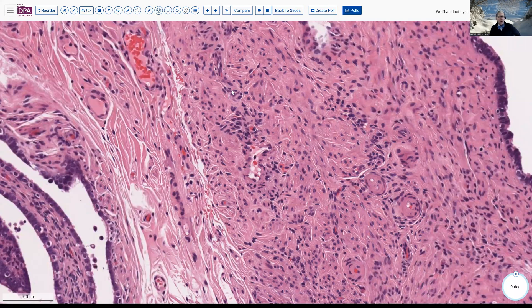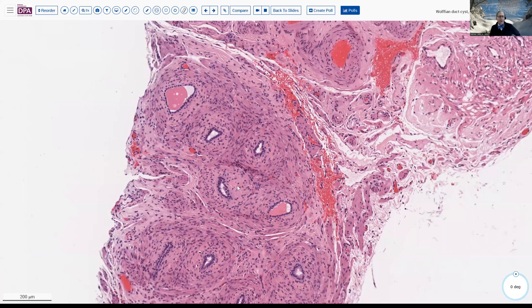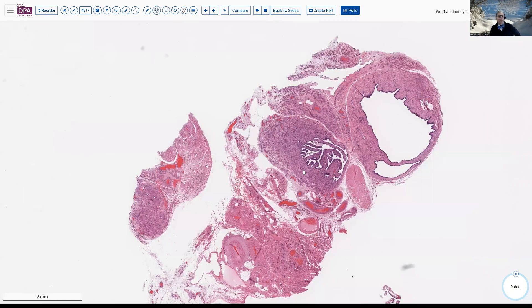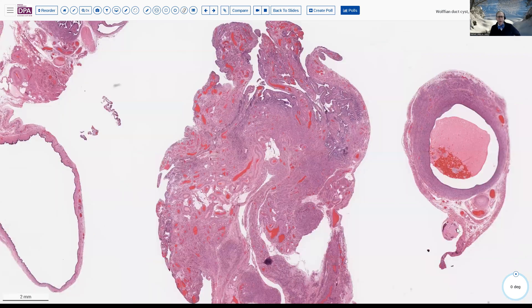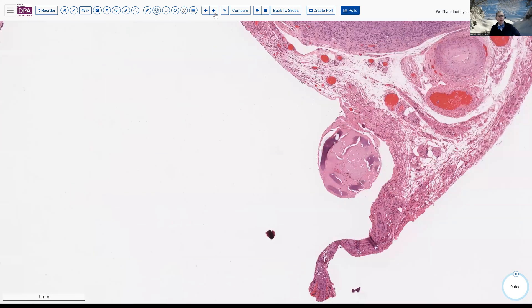In the situation where you have the tube adjacent and then the cystic structure, it's quite easy to make the diagnosis of Wolfian duct cyst. Here we see Wolfian duct remnants without cystic dilatation, and it's likely that this particular remnant became more cystically dilated, giving us that appearance. We also note a little serosal hyalinized nodule — a minor incidental finding.